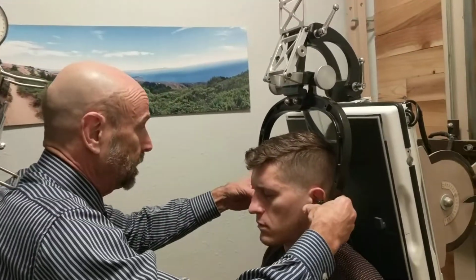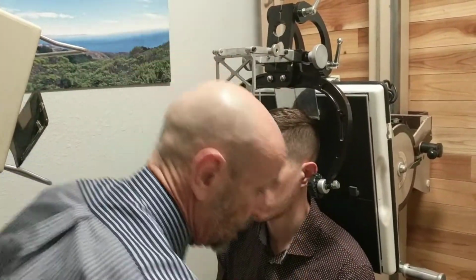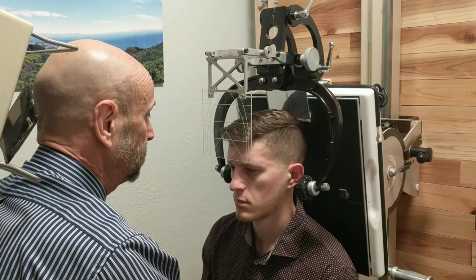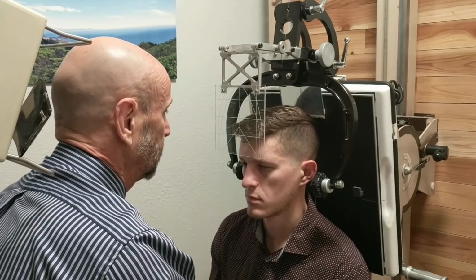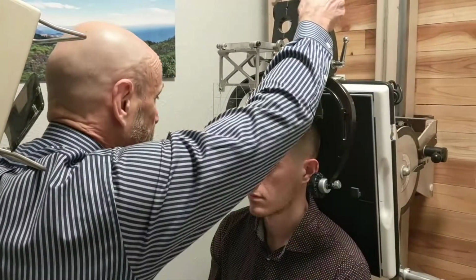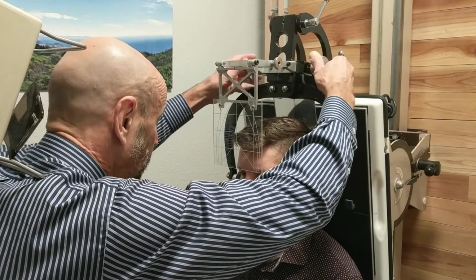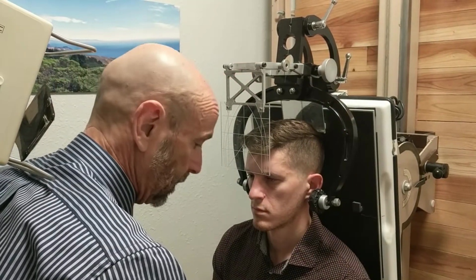So now the patient is asked to open the eyes, and what we're going to do then is move the chair. First, always move the chair away from the bucky when you're moving the patient. So we're going to move the chair away, estimating that the distance between the head clamps and the ears are about the same, and then watching for any movement to the patient's head, start bringing in the head clamps and adjusting as needed.